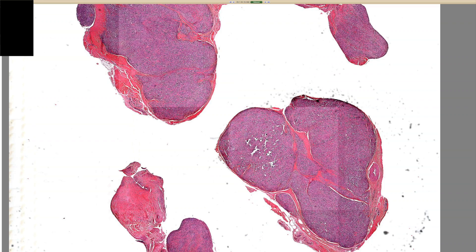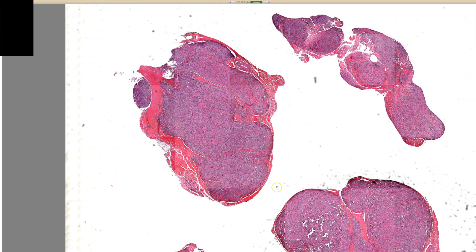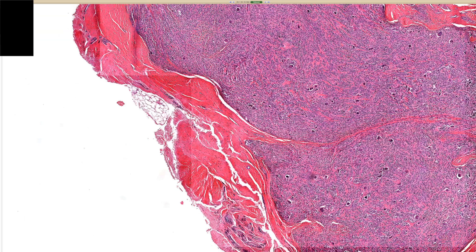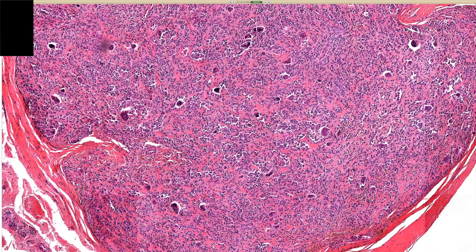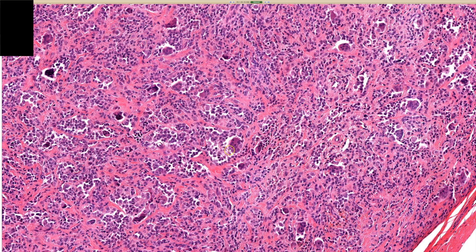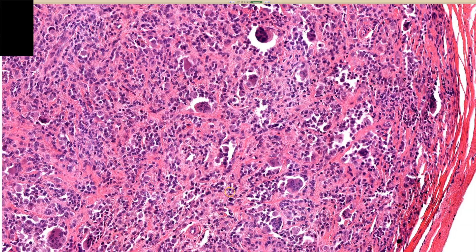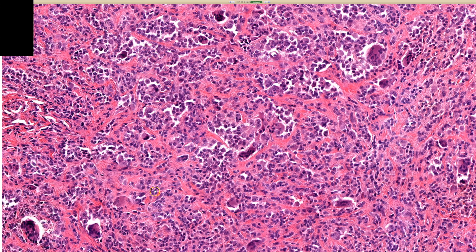We have a purple lobule, maybe multi-lobulated, looking lobular from here, with some dense collagen going through parts of it — very dense. Then we start seeing these cells that are jumping out at us, distinct from the rest: multi-nucleated osteoclast-like giant cells. That in and of itself makes me think of giant cell tumor of the tendon sheath.